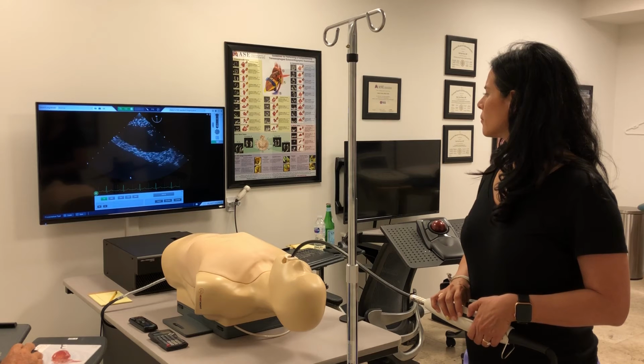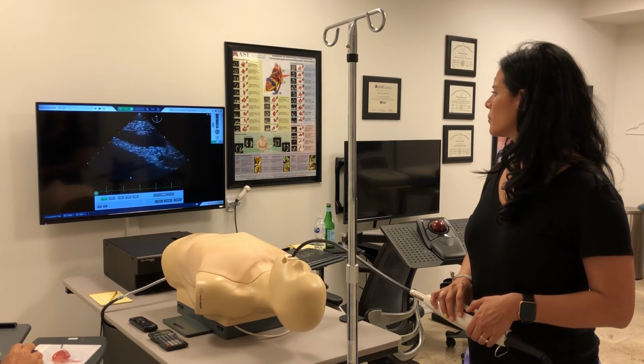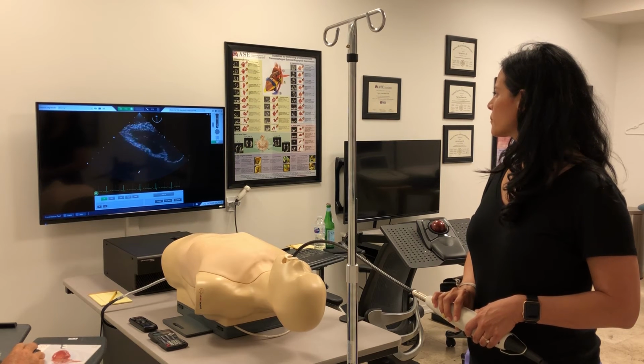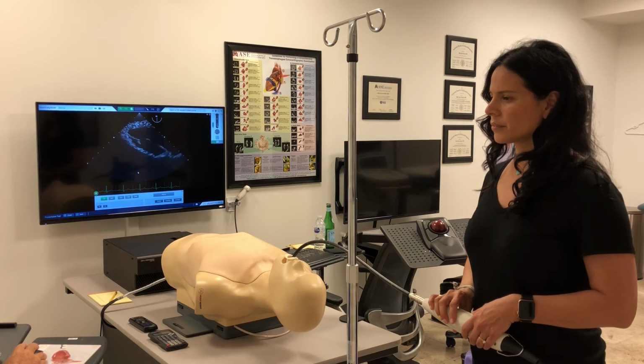Now the next view is based on this view, and it's the RV. It's the RV inflow view. And to get that, you simply have to rotate the probe over to the right heart. Well, that's going to be a right turn. And you can tell you're in the RV because the wall becomes so thin. Remember that the upper normal of wall thickness for the RV is 5 millimeters. Good, that's beautiful. So transgastric RV inflow view. Very similar to the TTE parasternal RV inflow view.